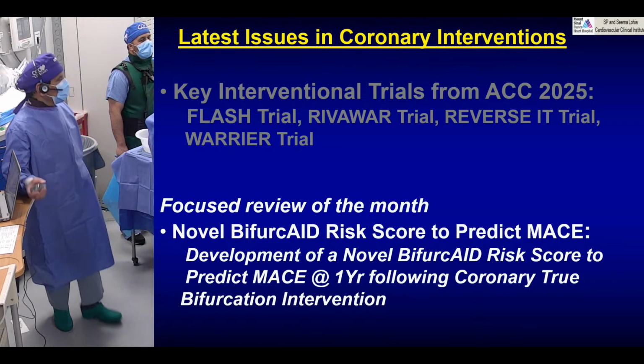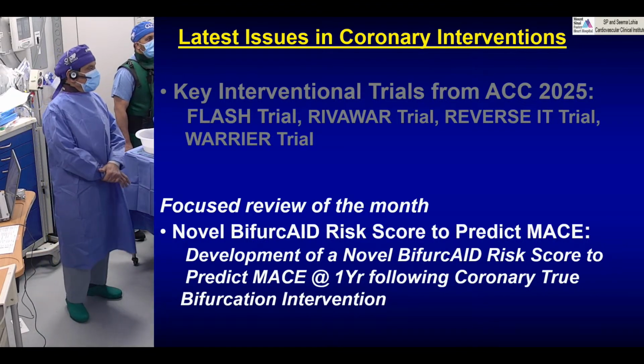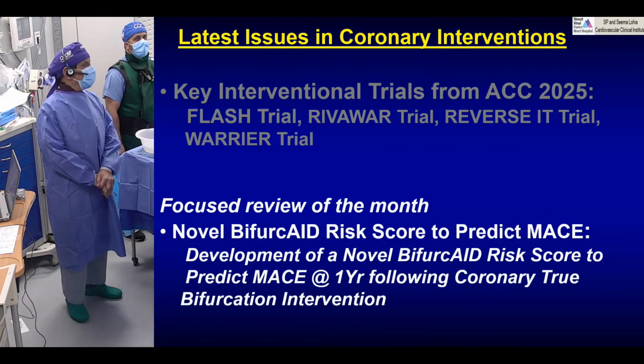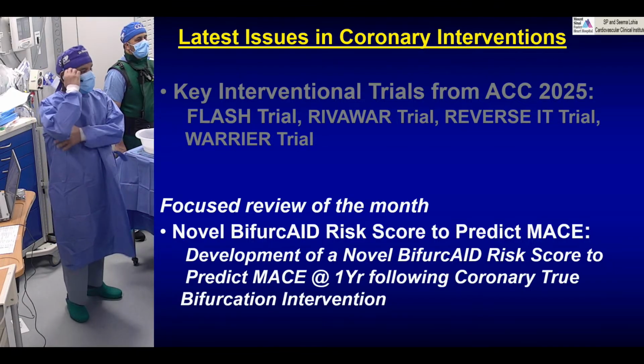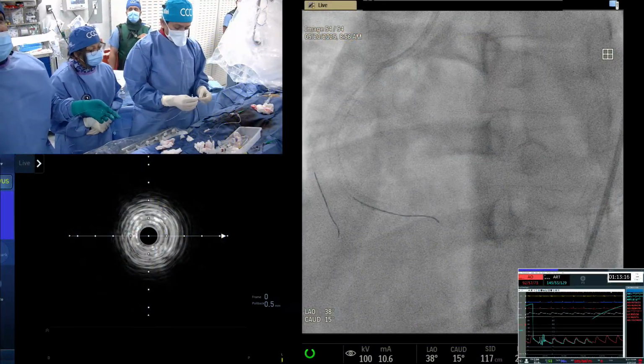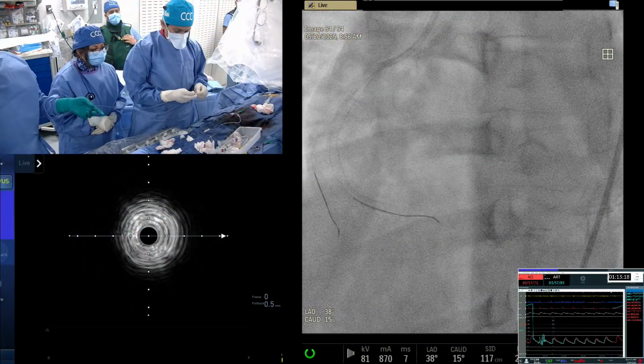So Anu, you want to show something now? We're going IVUS someday. Okay, you want to do it now? Yeah. Or we wait? Can I... No, finish? IVUS is going in. That's it, done. Okay. Then we're done. So now we can go to the next one... No, we are going IVUS. Okay, so IVUS is going to be shown live.